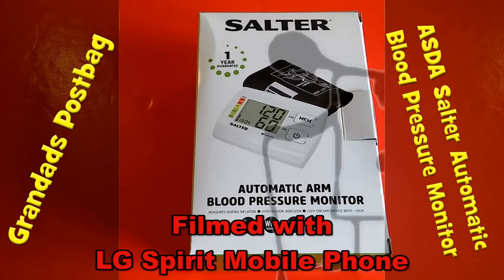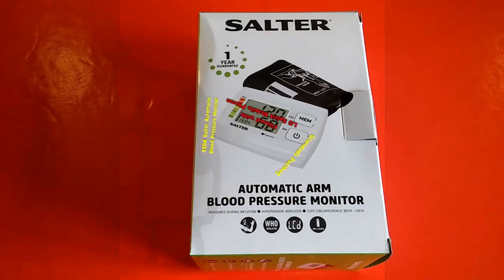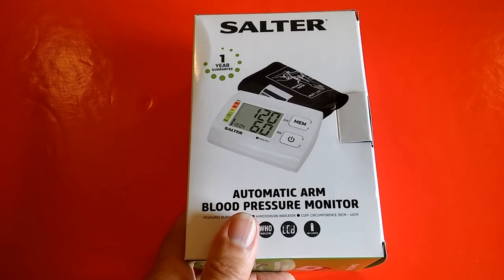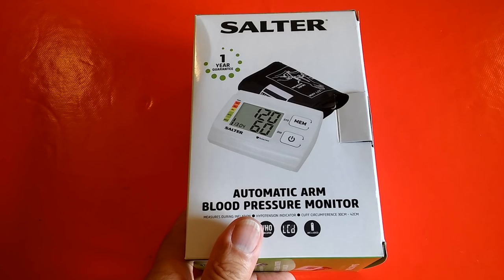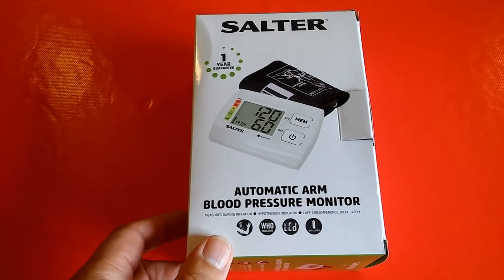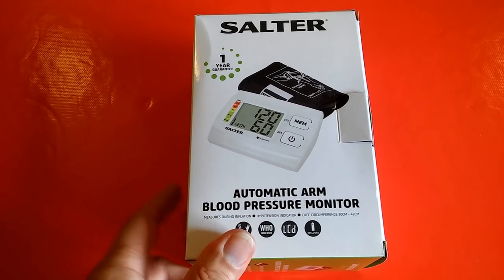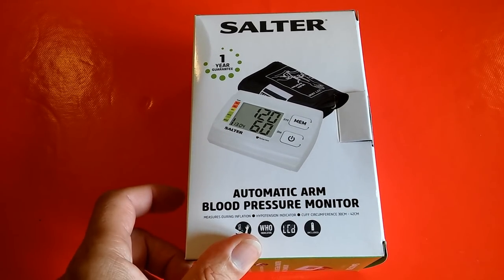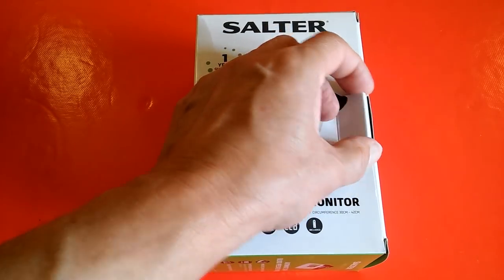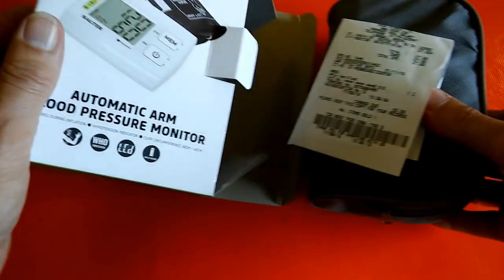Hi guys, got a new toy — something us old people need to do occasionally — an automatic arm blood pressure monitor. We've actually got one that goes on the wrist already, but doctors advised my wife we need to put one on the arm because they're more accurate. Just picked this up from Asda, £7.50.